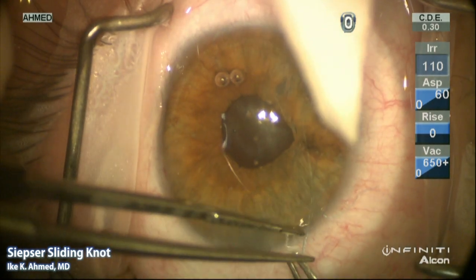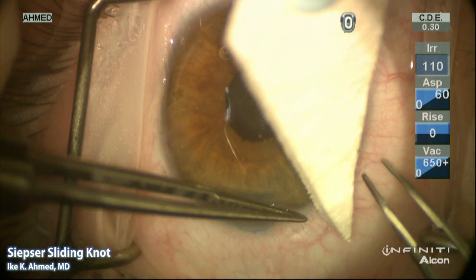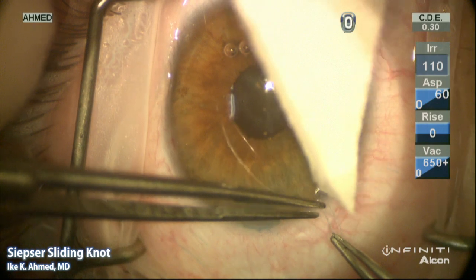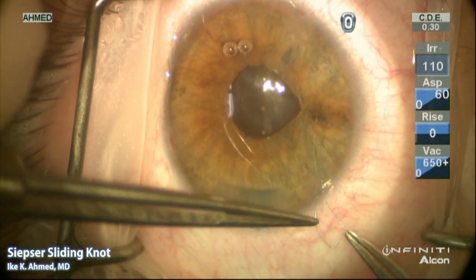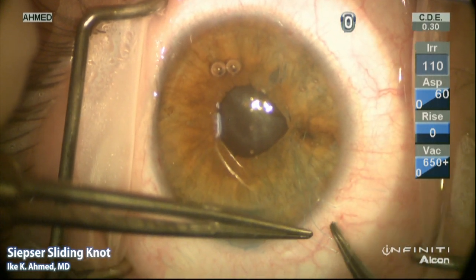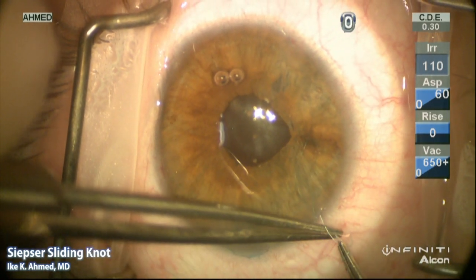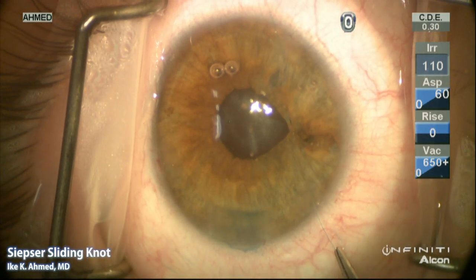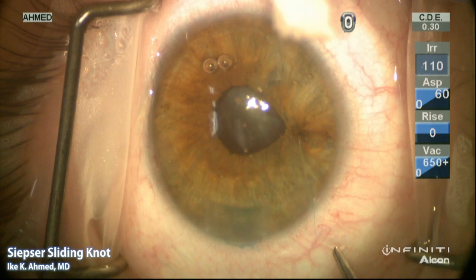The loop is untwisted to ensure that part one of the distal loop is oriented to the left side of the view, and that portion of the suture strand goes directly through the distal paracentesis as seen at the top of the screen. We now make the final single throw to secure the lock, and the distal strand is pulled to slide the loop along the proximal strand. We now have a secure knot.